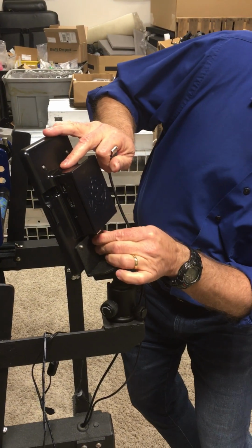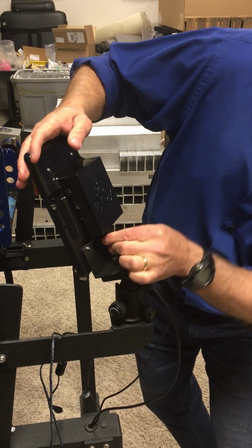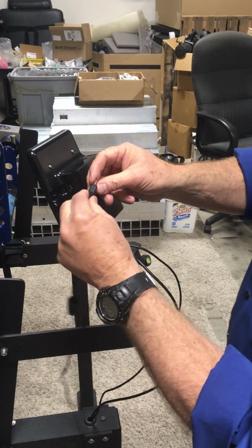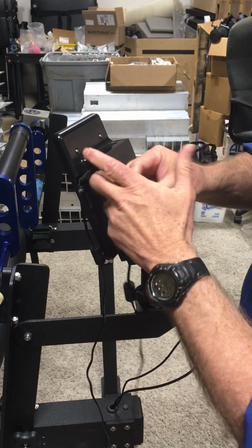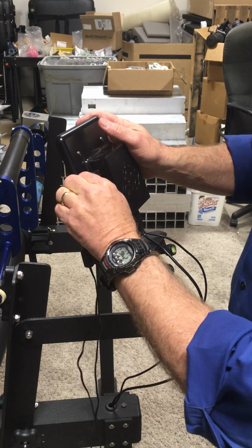display to the USB ports, plug in the power, being sure that the power is in completely and firmly. That's where we have a lot of problems with that.